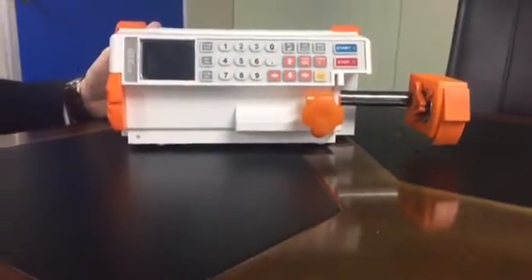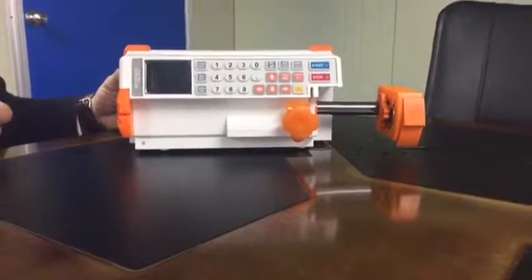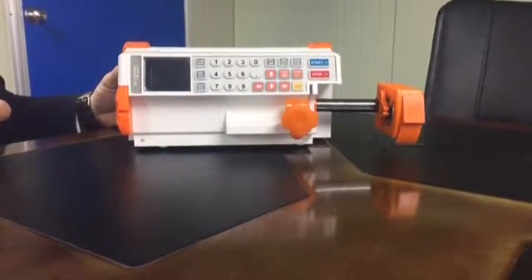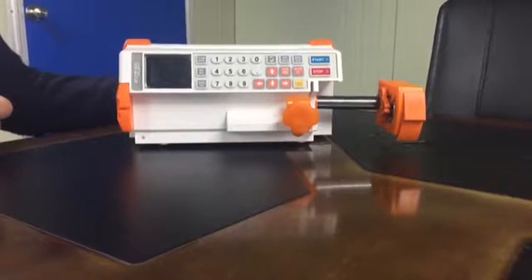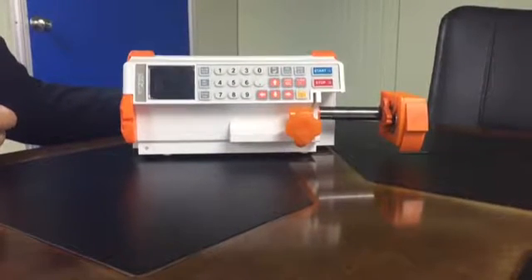Hi, I'm going to explain how to use this machine. This machine is a syringe pump manufactured by AMP All Korea. The model name is SP8800.